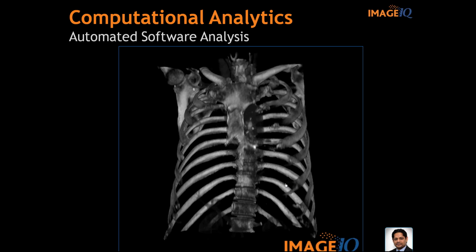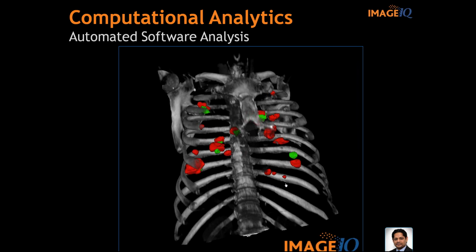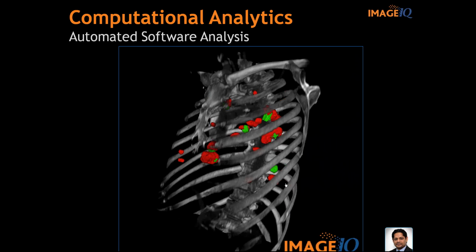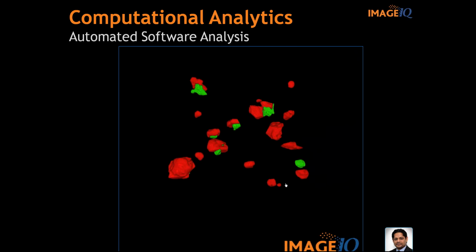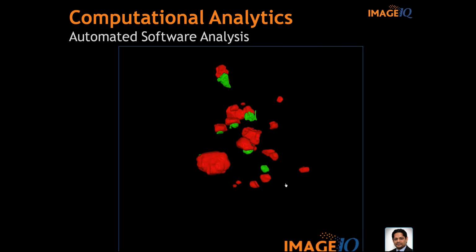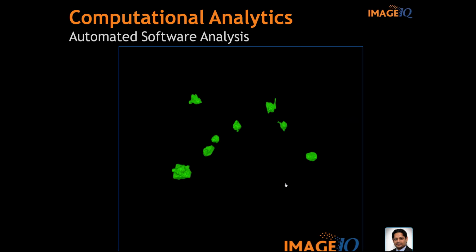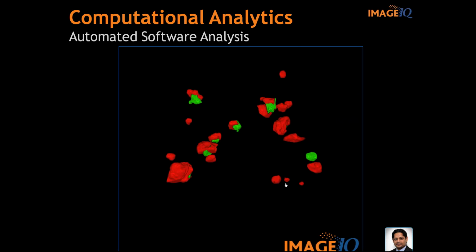This is just another view of that same patient, but now in 3 dimensions. It gives you a better view of the tumors, that they're not round, they're not spherical, they have this specific morphology of volume, right? And the red, again, is the second time point, and the green is the first time point. And you can see that there is appreciable change in the size of the tumors, even the shape of the tumors, over the 2 time points.